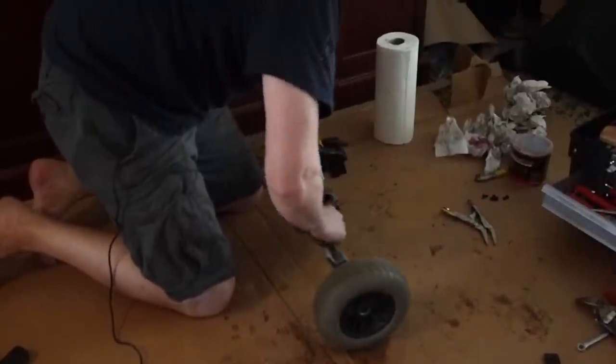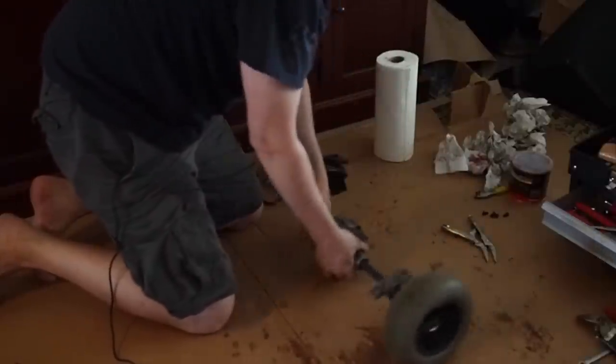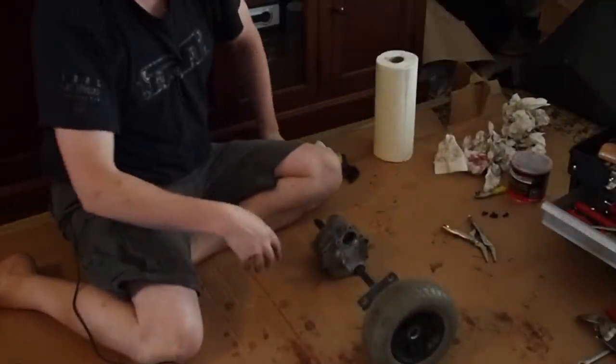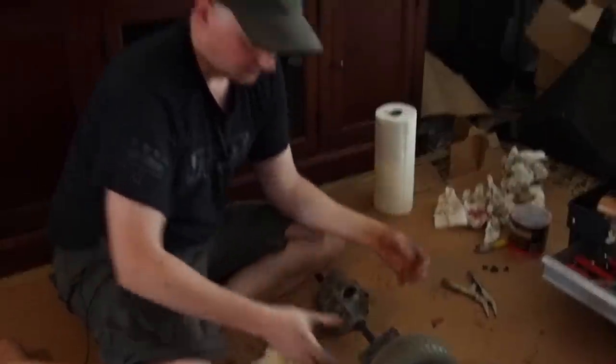I don't know, is that? No, that sounds a lot better than it was before. That doesn't sound like grinding to me. That just sounds like gears unwinding. So I'm going to call that good. It may not be perfect. I may have screwed something up, but I could do this a dozen more tries and not get it better. So let's call it a day and put this thing back together.